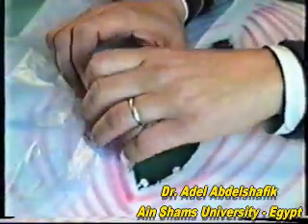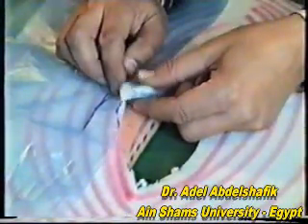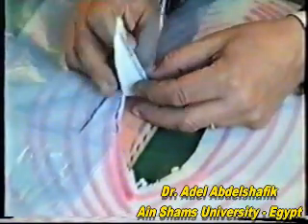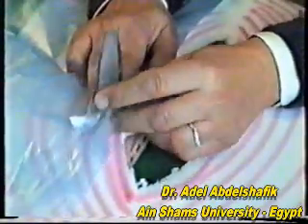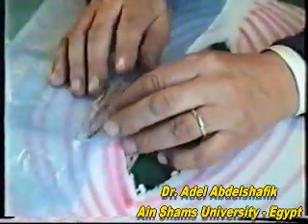Now we have two triangles, each attached at its base to the rest of the tissues. We free these two triangles, then re-suture them by swapping their positions — the lower one will go up and the upper one will go down.